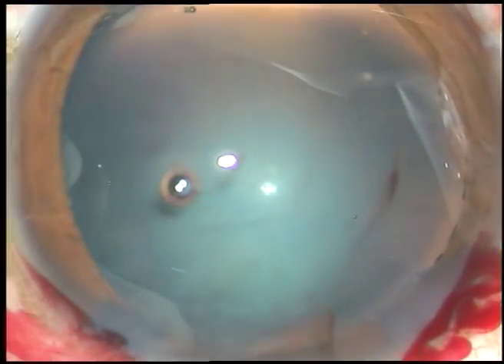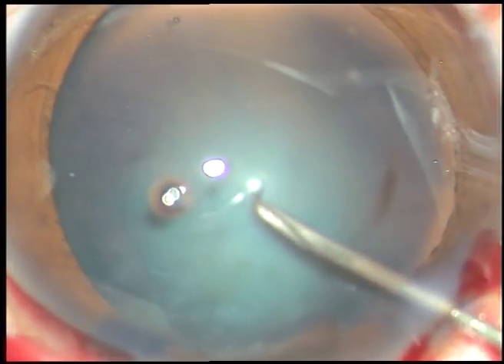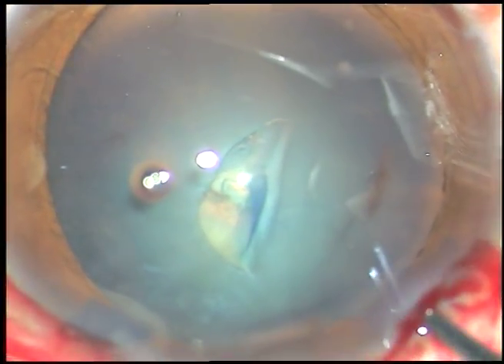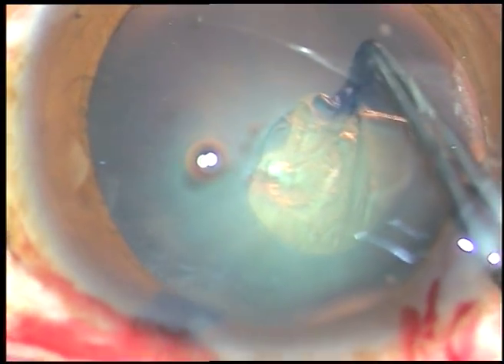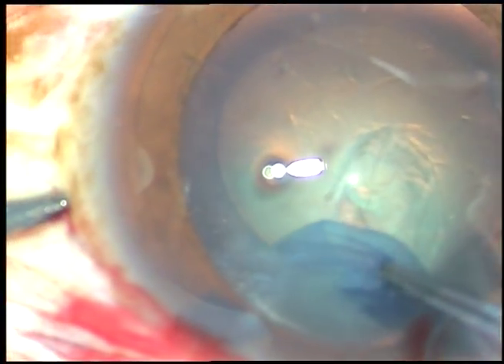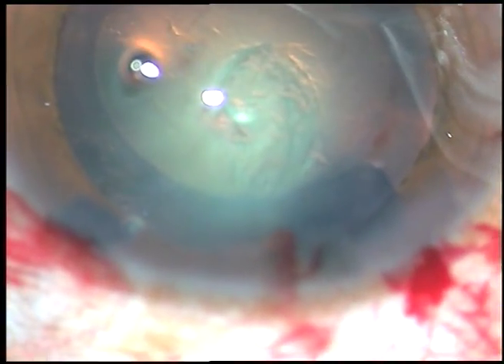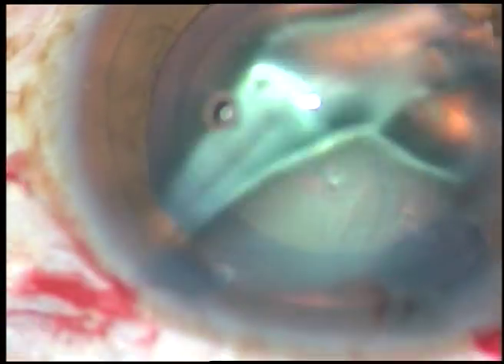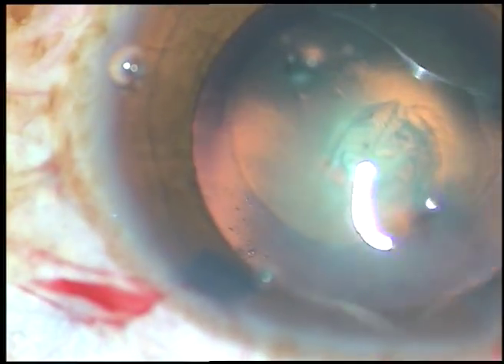Now see how I am going to do capsulorhexis. The 26-gauge bent needle is introduced through the main incision. The anterior capsule is cut and a nice flap is raised. I take the forceps, hold this flap, and remain at a certain equal distance from the margin of the pupil, and thus complete the rhexis. While using utrata forceps, an upward thrust is kept on the anterior lip of the main wound and leakage of viscoelastic substance is prevented.